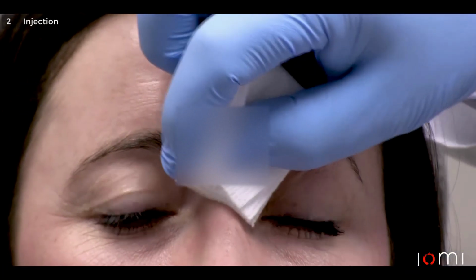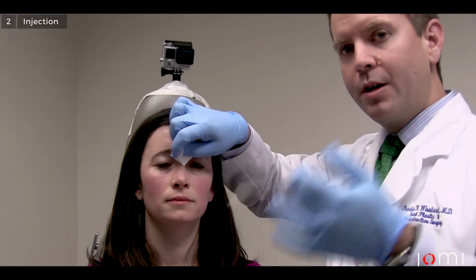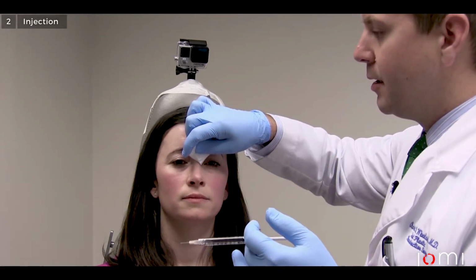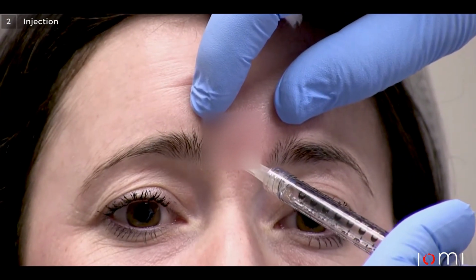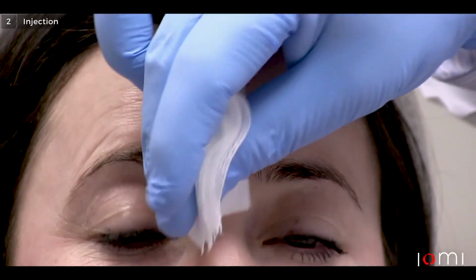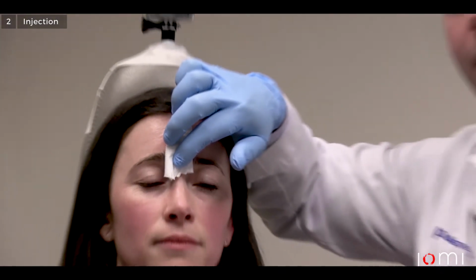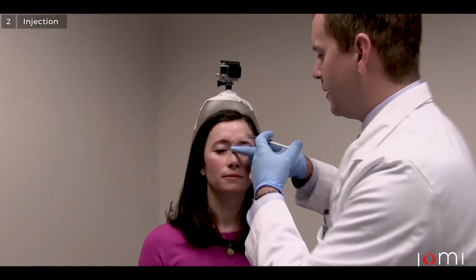As close as possible, you want to put the product in at around 90 degrees. You don't want to come in at a tangential angle because you're trying to place this product directly in the muscle you're trying to affect. So we'll do some symmetric injections of product in this region. I'm going to treat each of the corrugators with 5 units of Botox, and then I'm going to put 5 units of Botox in the procerus region because I think her procerus activity was a little higher, and again, we didn't see as much activity in her corrugator region.